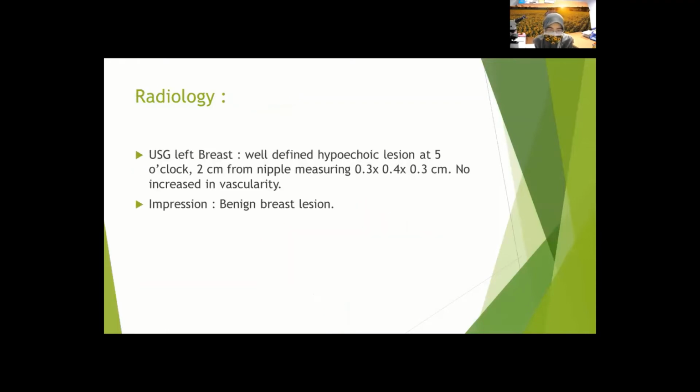Radiologically, it shows a well-defined hypoechoic lesion measuring less than 0.5 cm, and there are no suspicious features. So their interpretation is benign breast lesion.